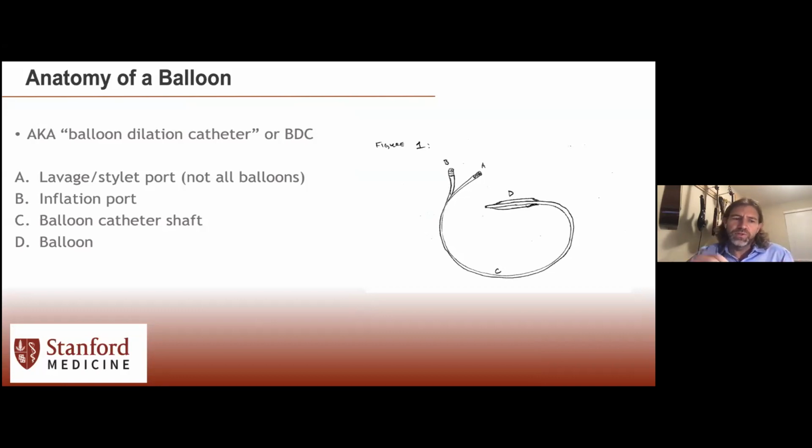You blow them up to their burst pressure, and the outer diameter listed on the balloon is what you get. You put one in an endotracheal tube, and they can dilate the endotracheal tube. You can stand on it. It'll lift you off the ground. They're very strong. In contrast, there are other balloons like the Boston Scientific balloon, which are compliant. And they actually have some squeeze to them.